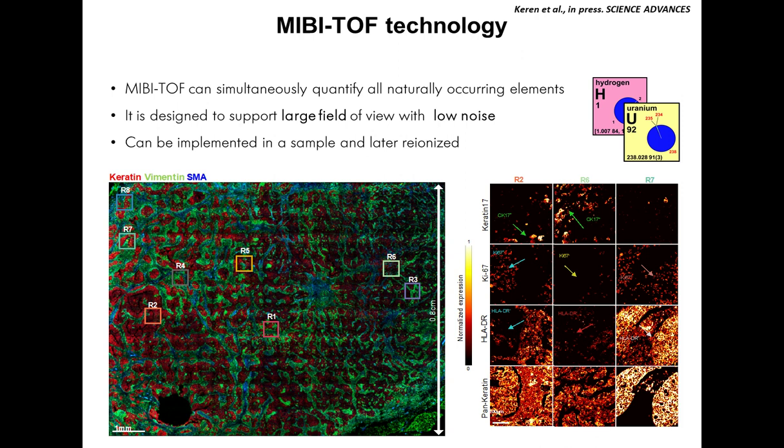And also, as you can see on the next set of images on the right, it allows for repeat scanning of a single section, for example, a specific region of interest identified during the survey scan. In this context, region 2, 6, and 7 of breast cancer tissue, enabling study design at different scales of throughput and resolution, or even acquisition of multiplex three-dimensional images.